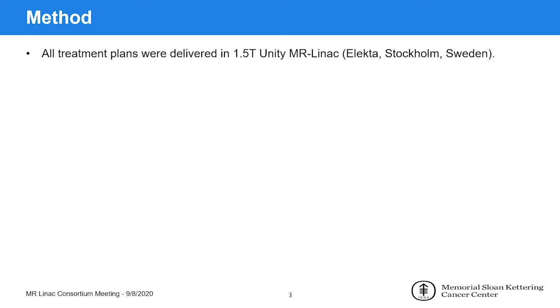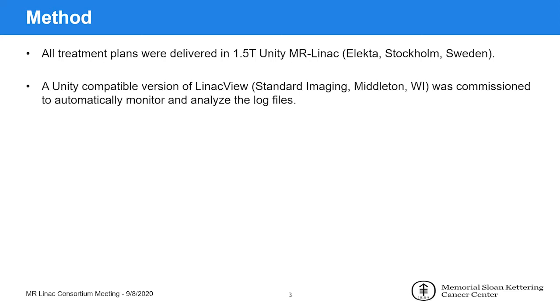In this project, we worked with Standard Imaging, which has a product, Linac View, that is compatible with non-MR Elekta systems. We worked together to get this product to work with the new format of the Unity, which is very different from the conventional non-MR system.